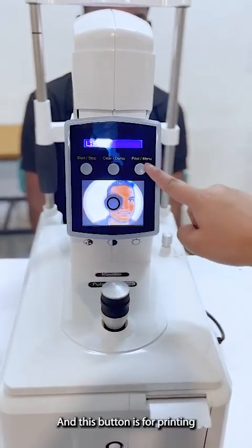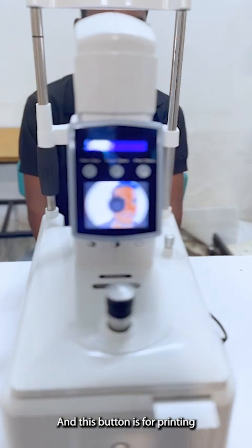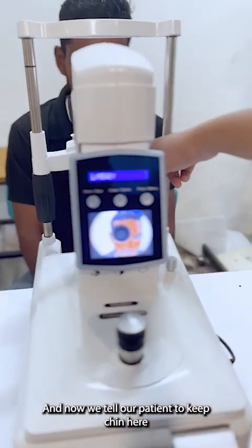This button is for printing. Now we'll tell our patient to keep the chin here.